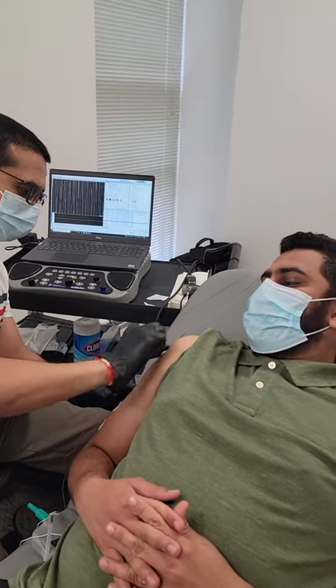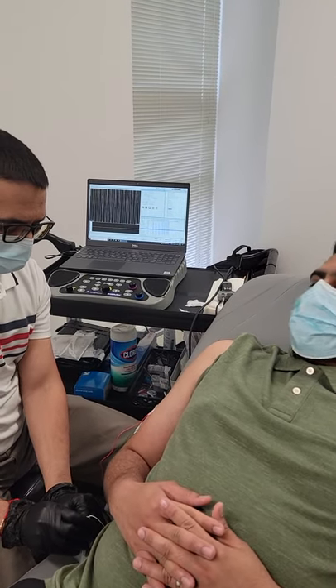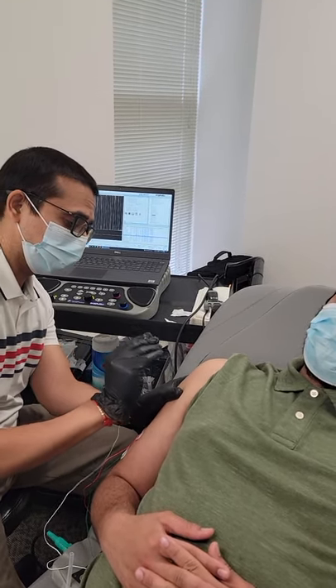Are you okay, Dr. Bihang? Pretty good, pretty good. Good. You won't even feel anything when I put the needle in — okay? Completely fine. If you feel anything, just let me know. Okay, here you go.